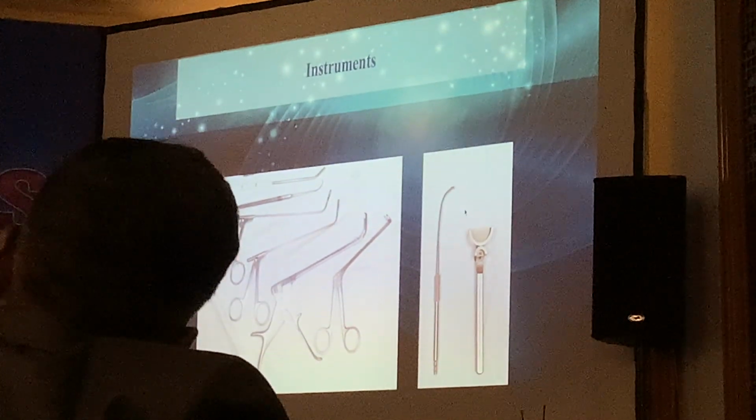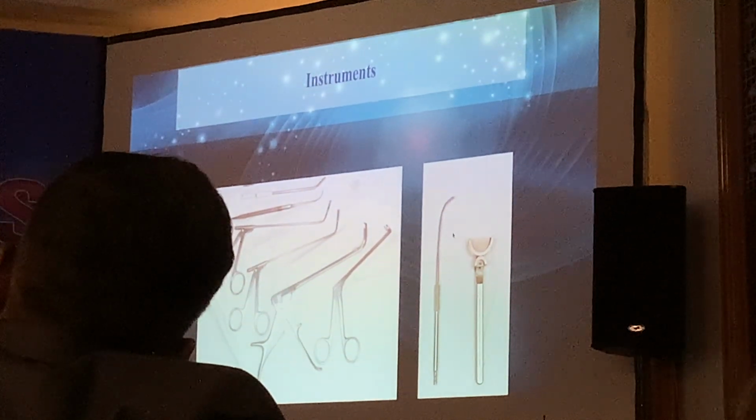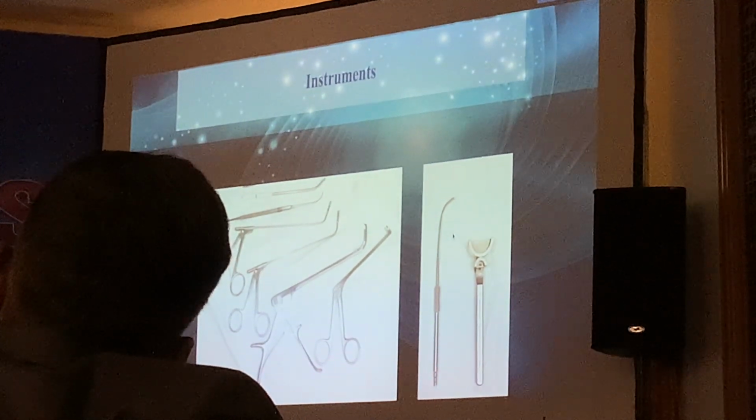This is the instrument. You need the curved instrument, a microdebrider, and also my favorite instrument is the suction curette, a malleable one, so you can reach almost all the cells.